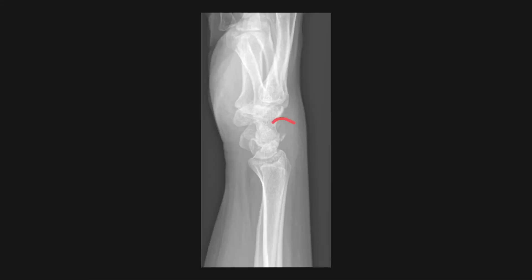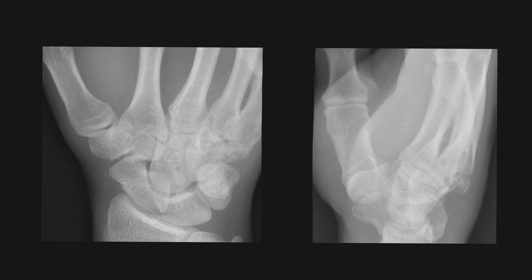Looking at other carpal bone fractures, this bony fragment seen posterior to the carpus is in keeping with a triquetral fracture.